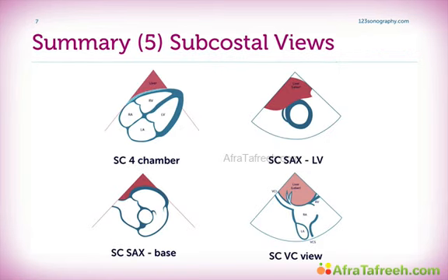The subcostal views are very important as well. You can get a view which is very similar to the four-chamber view, but this time you have the septum slanted more towards the right of the screen. You can see the pericardium very nicely and the four chambers.